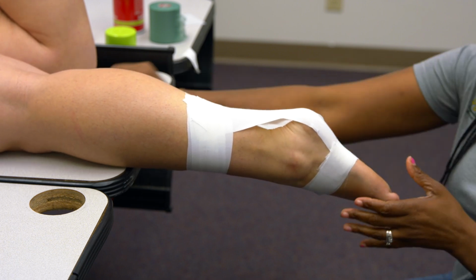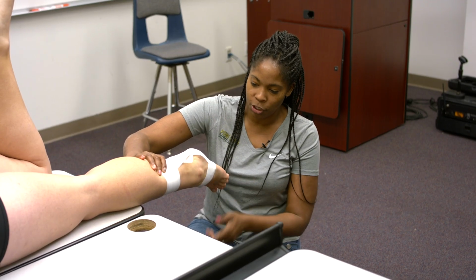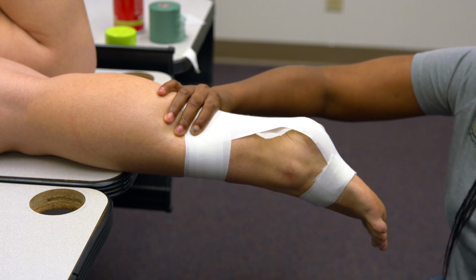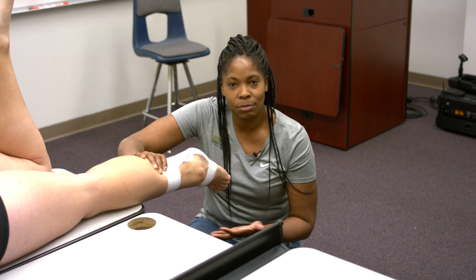And so now, to test the effectiveness of your tape job, what you're going to have your patient do is try to dorsiflex. So move those toes to your shin if you can. You guys can see how we limited dorsiflexion range of motion. The goal of this is truly that, right? If we limit dorsiflexion range of motion, keep in mind that we take the stretch off of the Achilles tendon and we start to see the signs and symptoms of our patient resolving relatively quickly.